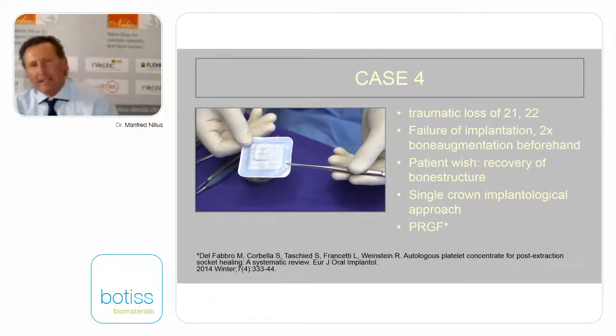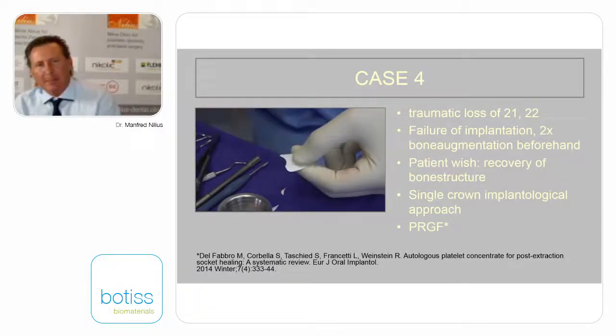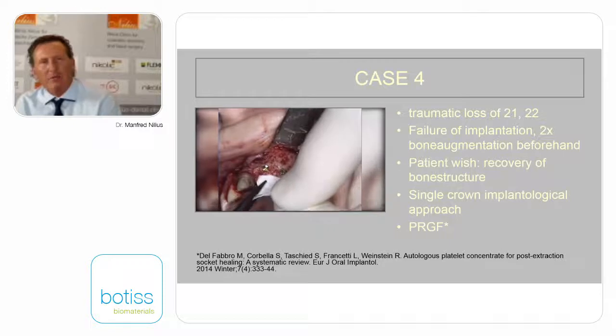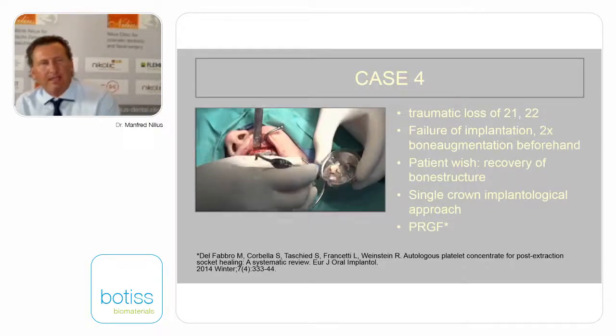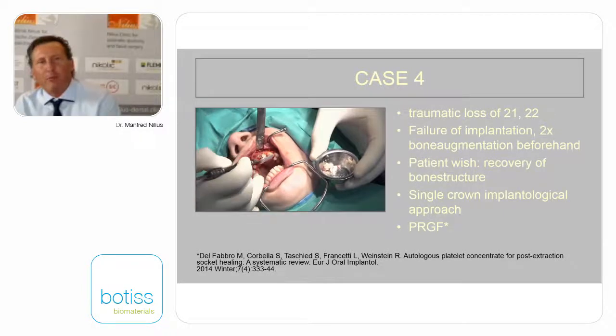In all of these cases, or in most of these cases, it will end up that you have an exposed membrane to the oral cavity. And for that reason, it is mandatory to have a safe augmentate under the titanium membrane.